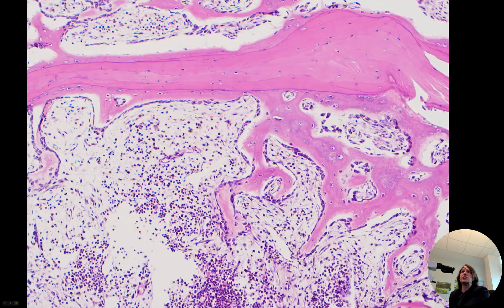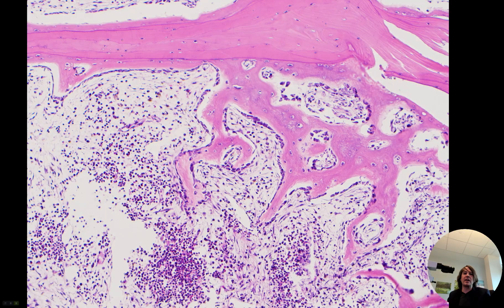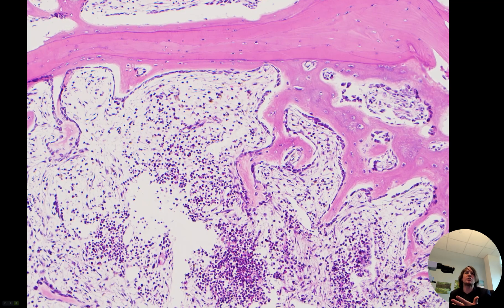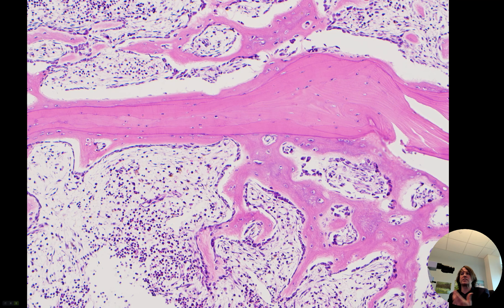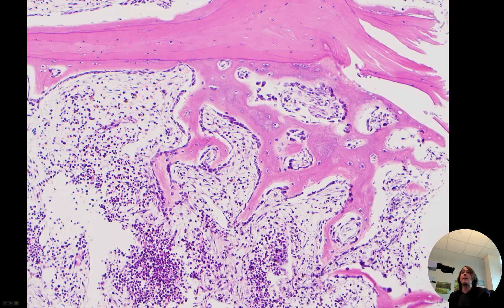When they went in to do a kyphoplasty — where they inject some cement or glue-type substance in there to stabilize the bone and help reduce the pain for the patient — they oftentimes will take out a little core of that bone. We can check and make sure that there really is just fracture change and that there's not, say, metastatic carcinoma, a tumor, or something else going on. So a lot of times where they've already put that needle in to do the kyphoplasty procedure, they'll take out a little core of bone for us to check under the microscope.